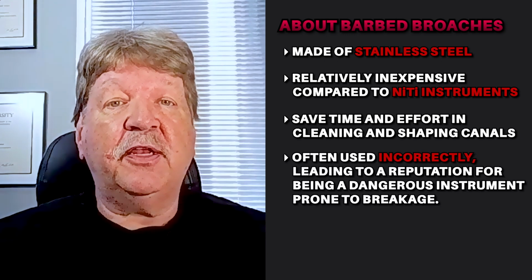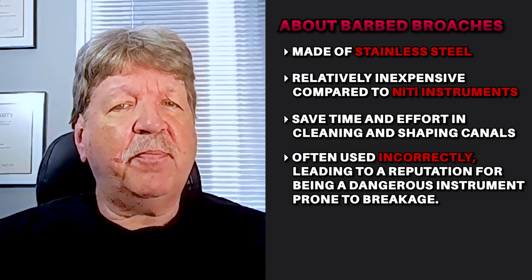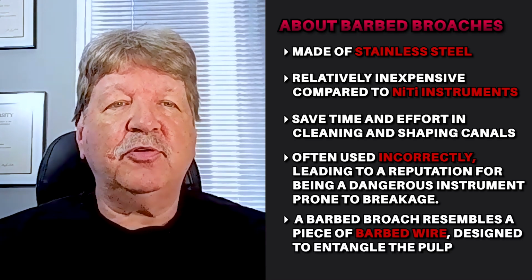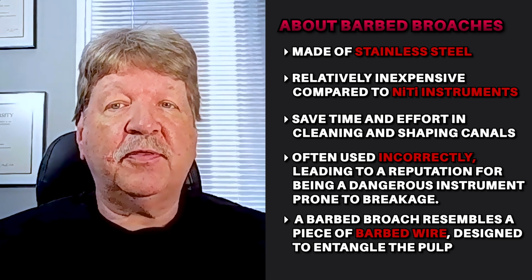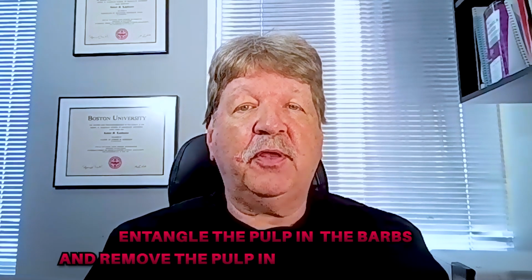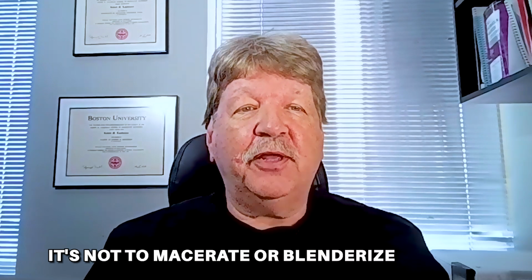Broaches are often used incorrectly and have gained a bit of a reputation as being a dangerous instrument prone to breakage. The barbed broach is nothing more than a wire instrument that's been notched in such a way that it resembles a piece of barbed wire. The barbed broach is used to entangle the pulp in the barbs and remove the pulp in one piece if possible. It's not to macerate or blenderize the pulp.